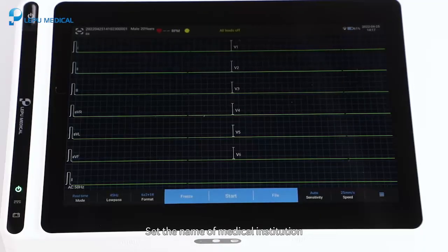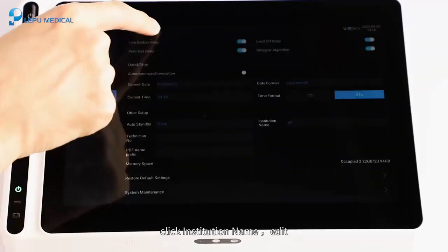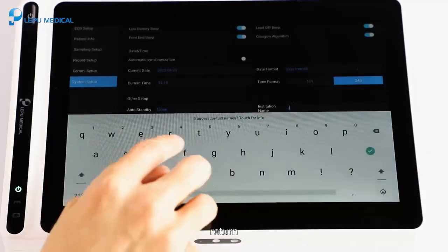To set the name of the medical institution, click Setup, then click System Setup, then click Institution Name. Edit the name and click Return.